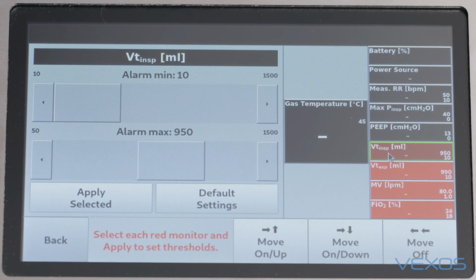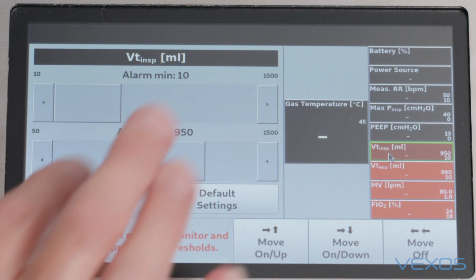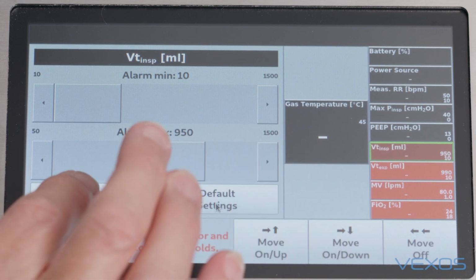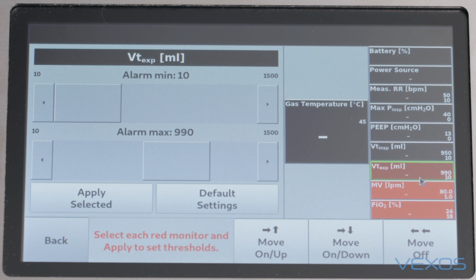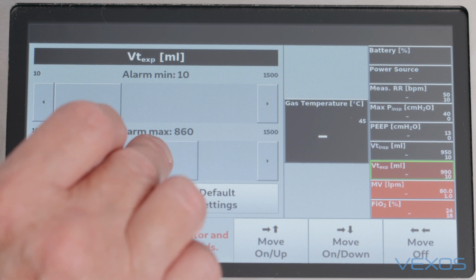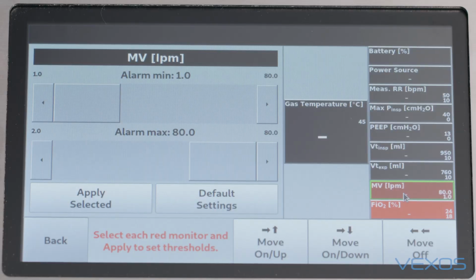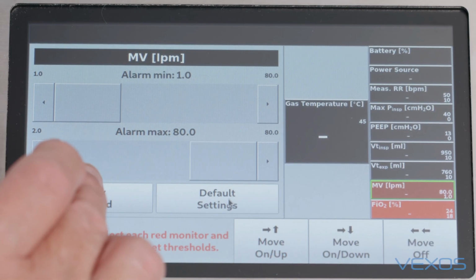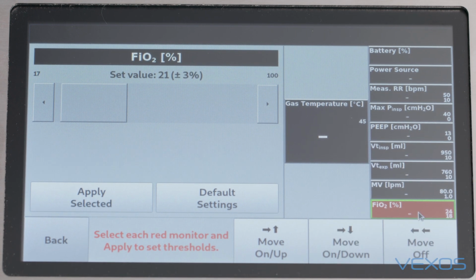Same thing, I can either use the default settings or I can change them as I wish. Either way, I need to apply them. So I'm going to apply the defaults. Next one is the expiratory tidal volume. Same thing, I can either choose the default settings or I can change them as I wish, and I apply. Next one, minute volume, same thing. I can choose default or I can adjust as I wish and apply. And the last one is the FiO2.